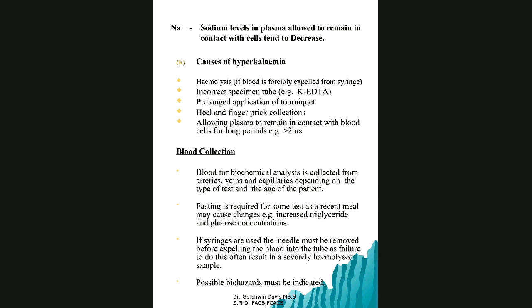We've crossed the midpoint. Causes of hyperkalemia. In my layman's terms, this is a sort of non-medical, non-clinical issue here, more of a lab issue. Hemolysis, some people mentioned that already. Wrong specimen tube, somebody mentioned that already. Prolonged tourniquet, fingerprick, all of these may cause it, for example heel and fingerprick collection. You're actually milking the blood, and that can cause hemolysis. Delayed separation, we went through that, right? Get back down to normal.